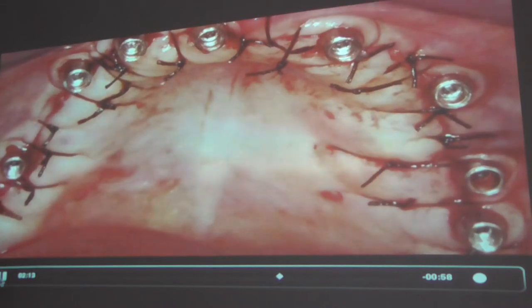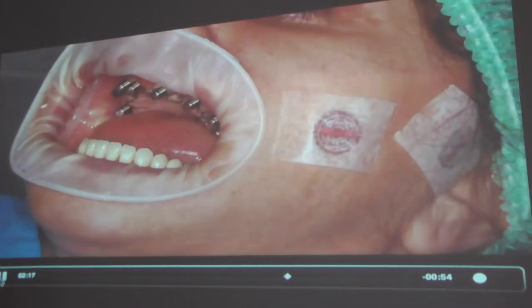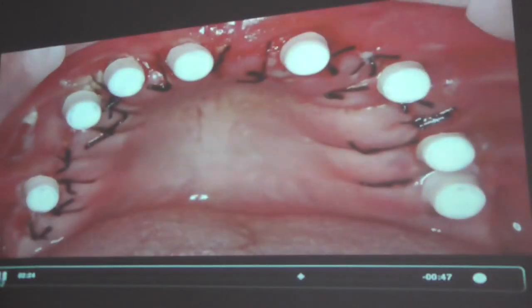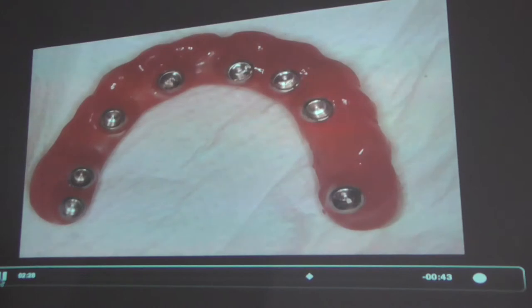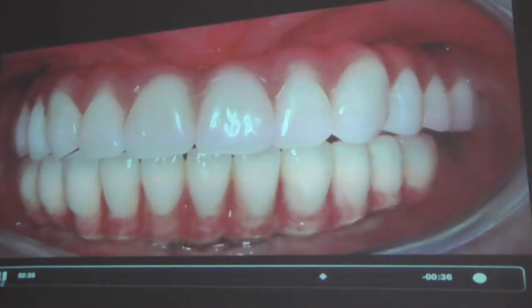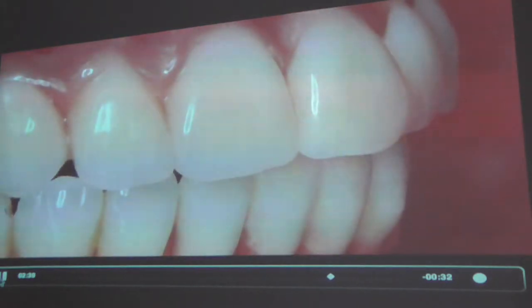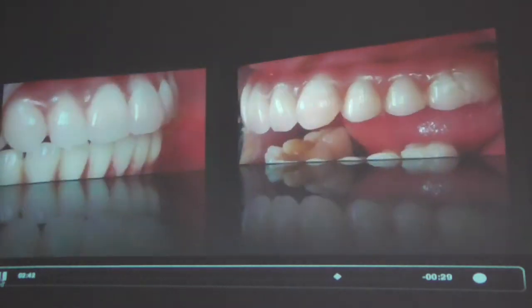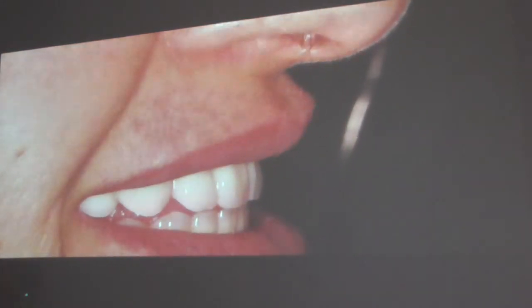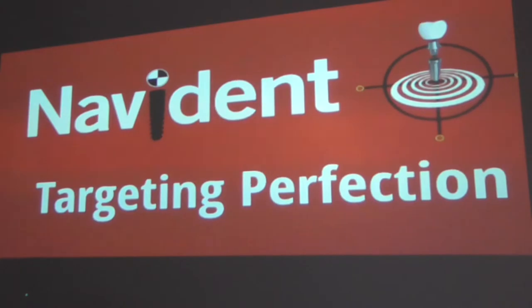Then I'm screwing the straight abutments, and those are the caps with friction. I'm taking the impression, which is done with the wax-up transformed into the prosthesis. Then I'm finalizing the prosthesis — with no holes and no glue, no cementum. That's the way I'm doing edentulous cases. This system is the AON system — an Italian company that makes these implants, abutments, and caps.